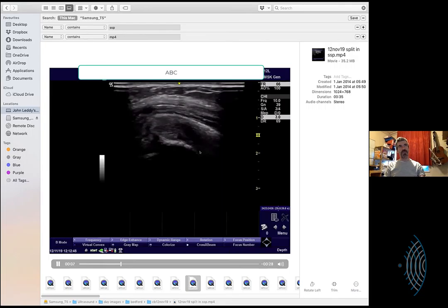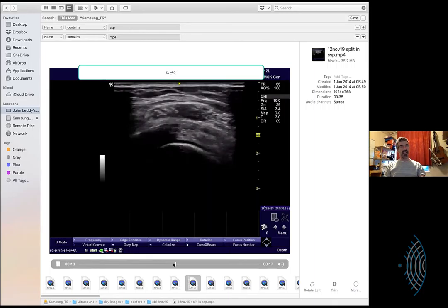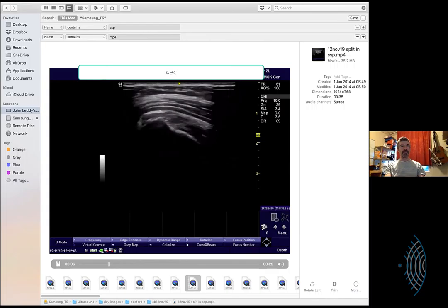This one I know you've seen before, but it's quite a good one, so I think you mightn't mind watching this again. So this is a slightly awkward supraspinatus. You can see I can't really get it out from underneath the acromion as much as I'd like to. But you can see there's a split in the supraspinatus. And there's your change. I think I went through there a bit fast, so I'll come back. Obviously busy that day.